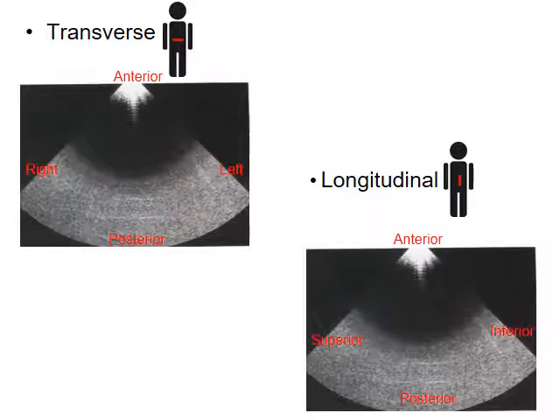If I now turn the transducer through 90 degrees and I go into a longitudinal plane, I am going to put the dot always to the patient's head. Okay, so don't put the dot towards the feet, put the dot or the dominant side of the transducer towards the patient's head.